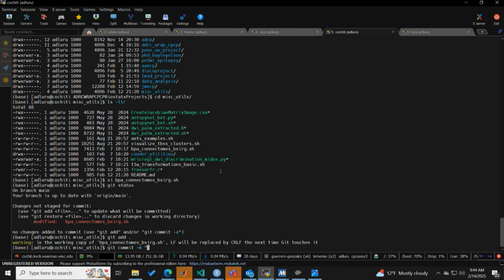because you do all the affine. So the log Jacobian is extracted after you get the alignments and affine registrations. These are very small local deformations. These are not big deformations. So all the big stretching and squishing, all the big changes, like if you're aligning a small circle and a big circle, I think I have an analogy I can give you after I commit this.